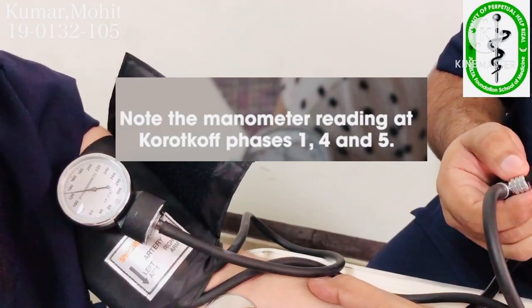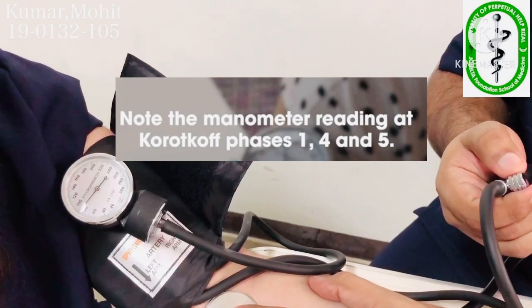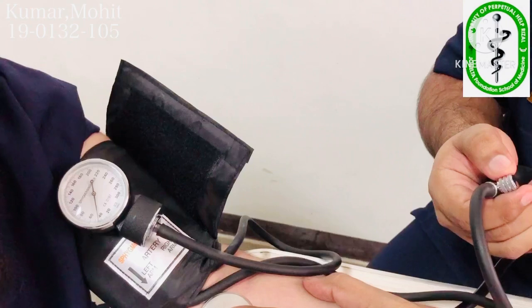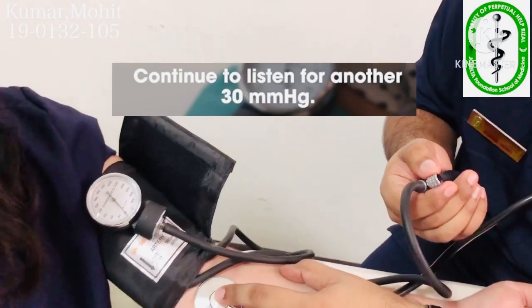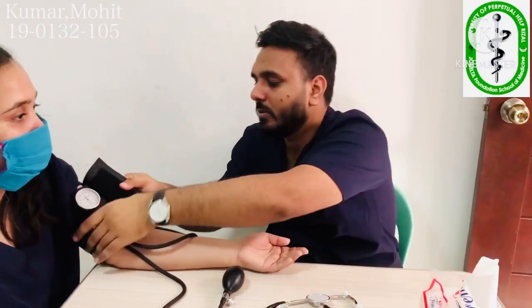We check our first point — I got my first Korotkoff sound at 110. The sound will disappear at 60. I observed it down to 30. Now it should be deflated. After taking the reading, we remove the cuff. As we have calculated, our reading was 110 over 60.